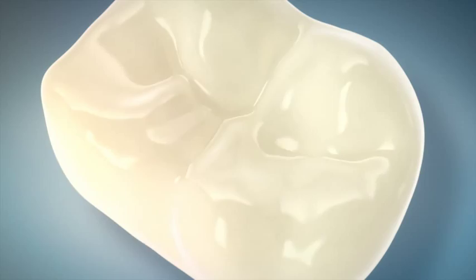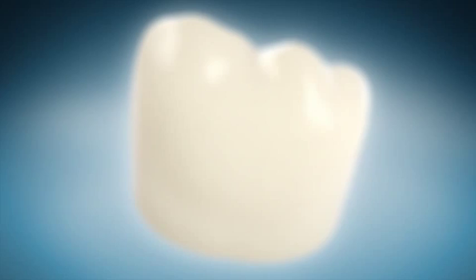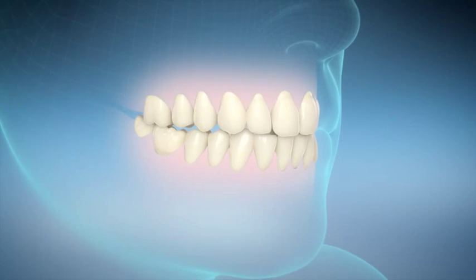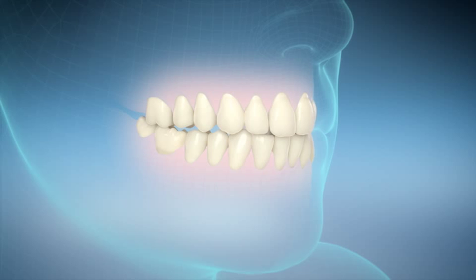The goal of every CAD-CAM treatment is a natural reconstruction of the tooth. The high translucency of this hybrid ceramic allows for a natural play of colors. Restorations integrate themselves perfectly into the remaining dental substance. And the patients are excited because the nature-like qualities of the material offer the patient a comfortable and natural chewing sensation.